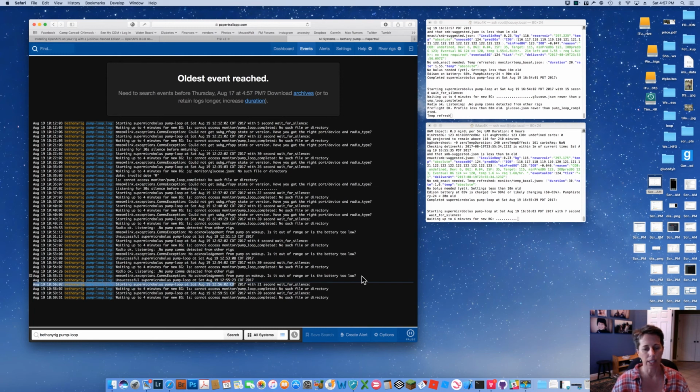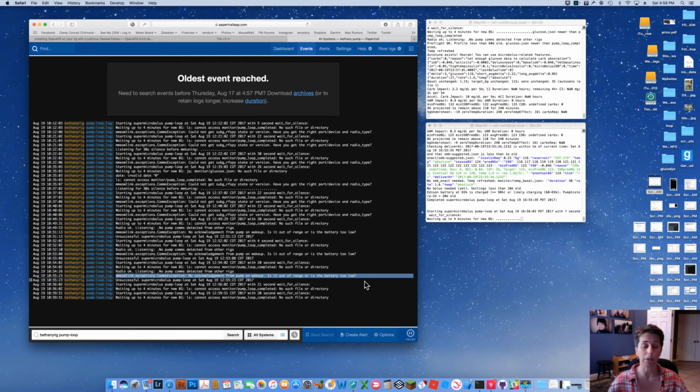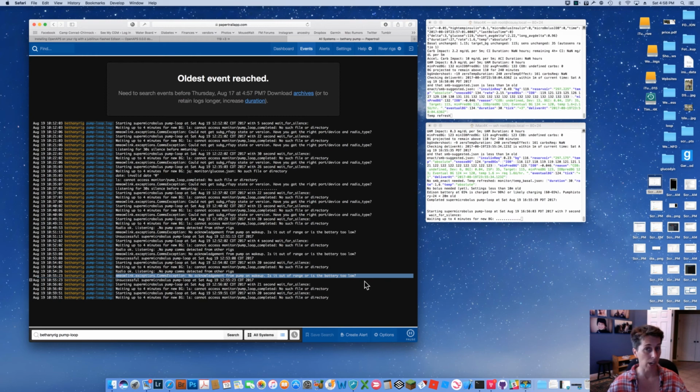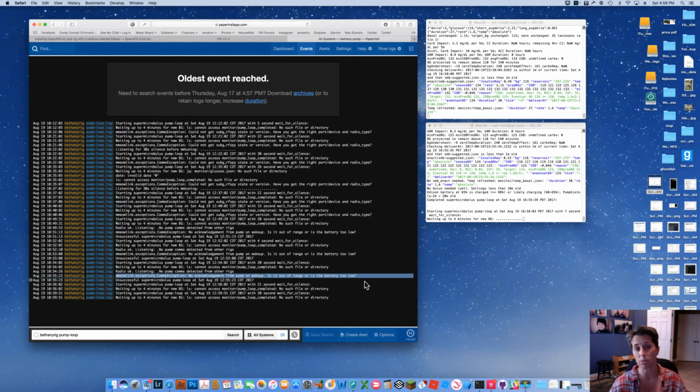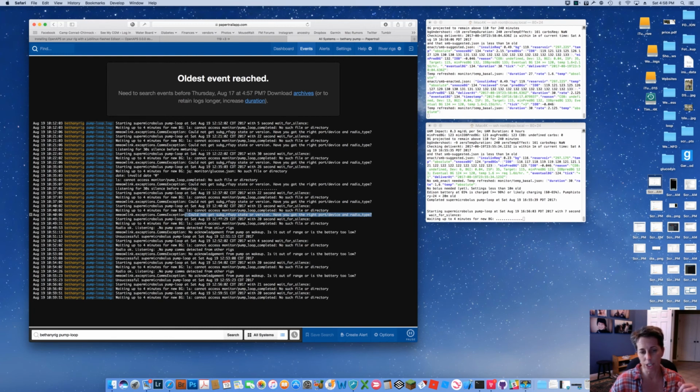This one here, no acknowledgement from pump on wake up. Is it out of range or is the battery too low? Obviously this is trying to send you a message. It's saying that the pump and the rig aren't communicating. The rig is trying, the pump isn't answering. The usual, most common reasons for the rig not answering is because it's too far away or the battery is low. This other message here, could not get state or the subg_rfspy state or version, have you got the right port or device or radio type.